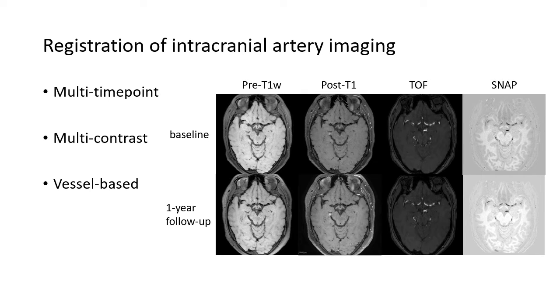Additionally, multi-contrast weighted imaging poses additional demands, making registration more complex because of the unclear intensity mapping relationship between different contrasts. In regard to intracranial artery MR imaging, accurate registration of vascular features becomes very critical for advanced vascular applications, where small, narrow vessels have to be accurately registered in order to analyze vessel lumen and wall features such as stenosis or plaque. However, existing registration methods, while suited to general and global brain registration, are not optimized for study of the intracranial arteries.